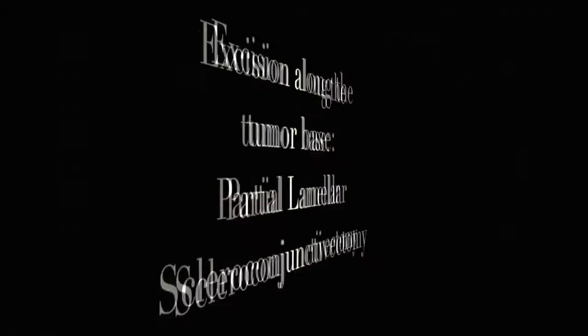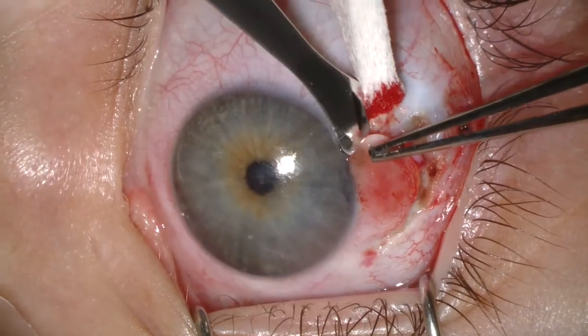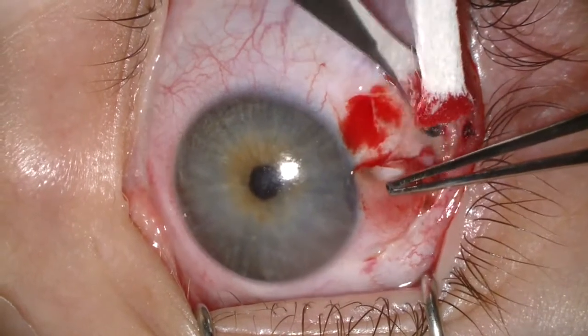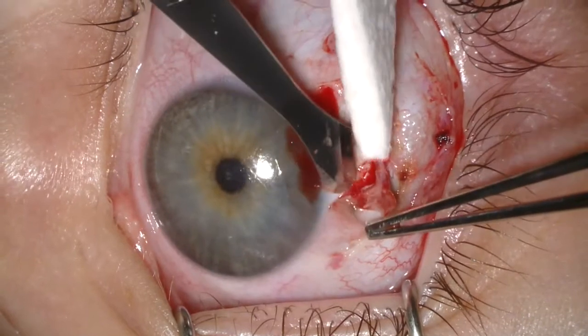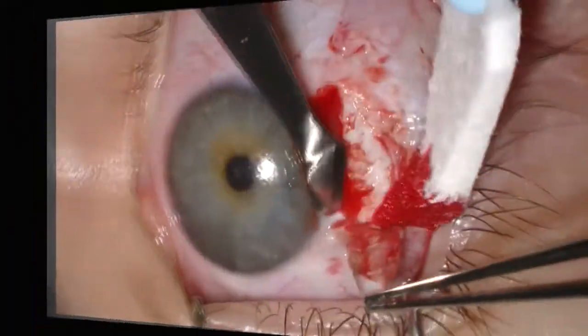especially in children. I use the 57 blade and I go from the corneal side out to the bulbar side, because this reduces the risk of causing Bowman's membrane damage. I take the entire tumor off, never re-grasping, always holding on the normal conjunctiva.